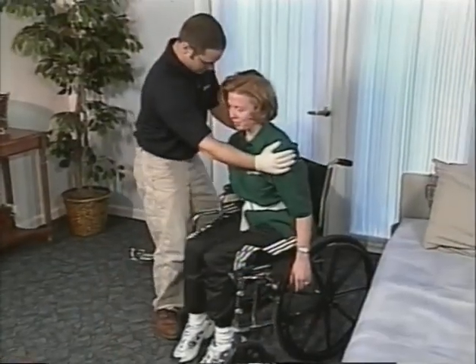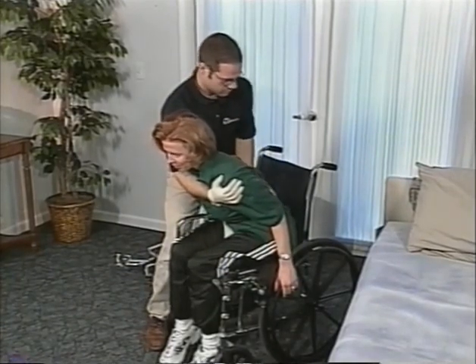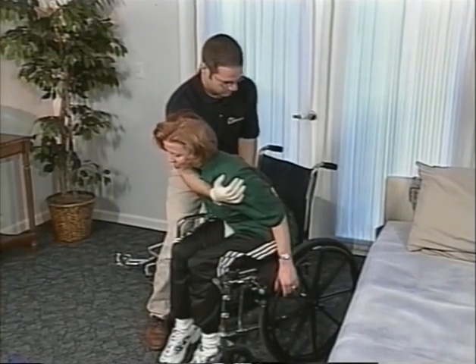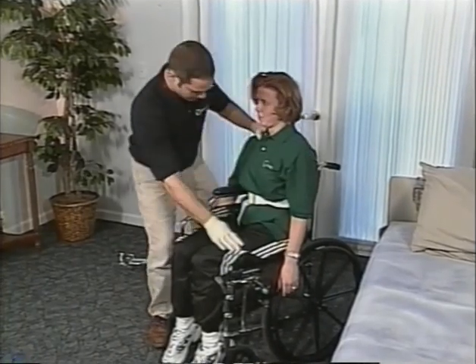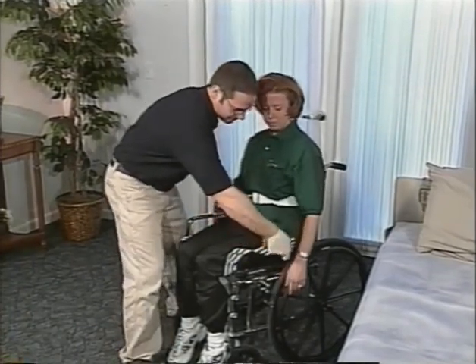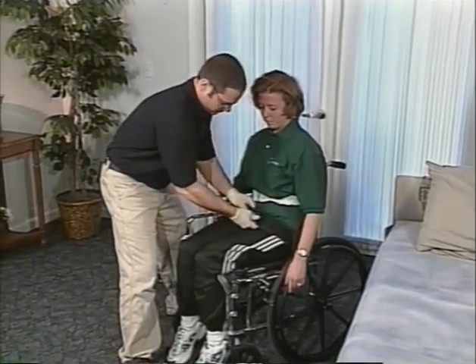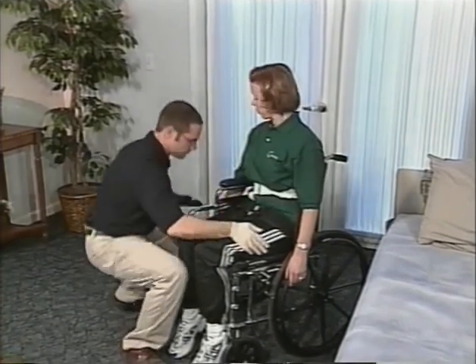To ensure the client is all the way back in the chair, lean their upper body forward and slide your flat hand between their buttocks and the chair back. If properly positioned, you should feel both surfaces with no gaps. Apply the seat belt and other positional straps. Replace the armrests and footrests.